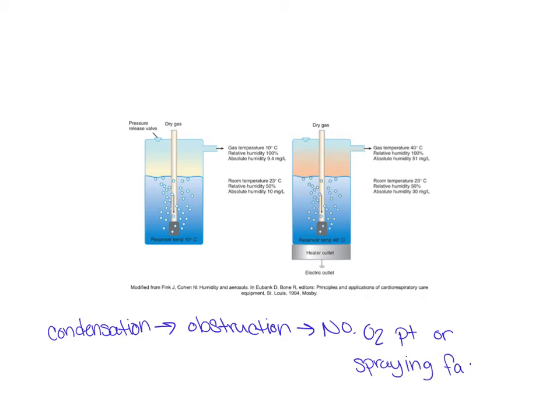And like we said, that bacteria likes to live in water. So if we have bacteria in that condensation, and then we are getting it into the patient, we're risking aspiration and further infection.